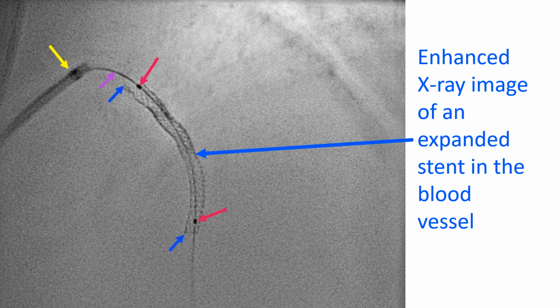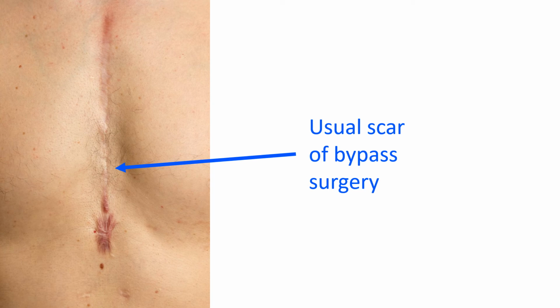One of the important disadvantages of angioplasty is the higher recurrence rate than bypass surgery, which is the alternative mode of treatment for severe blocks in coronary arteries. The chance for recurrence increases with the number of blocks treated. Hence, some may prefer bypass surgery for those with multiple blocks.